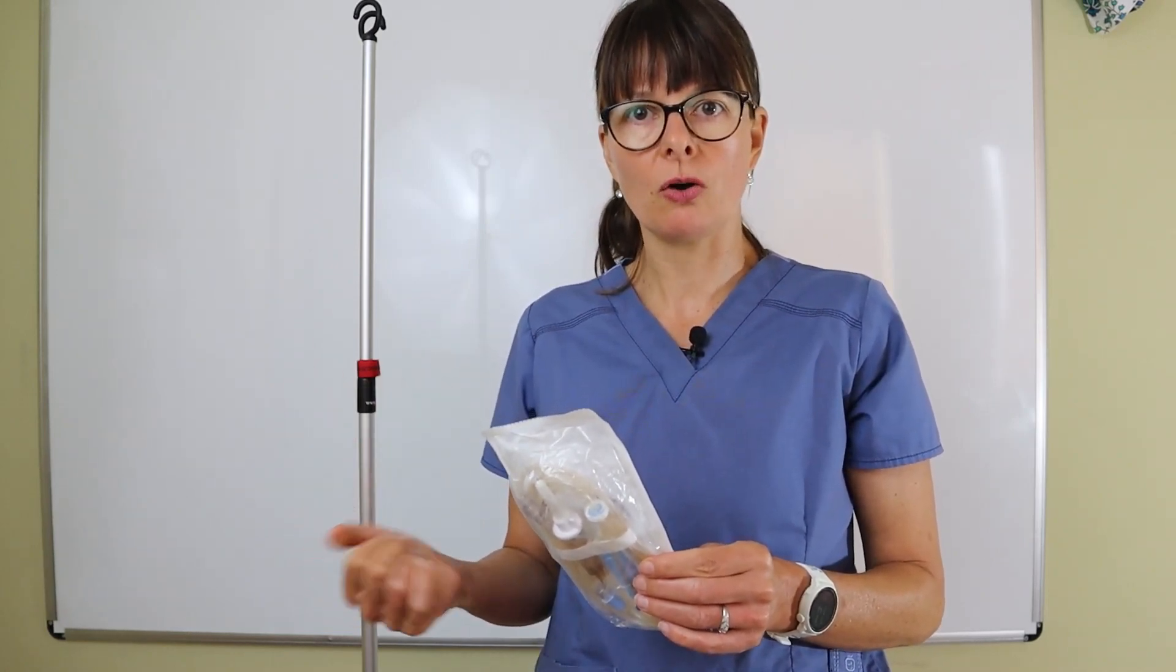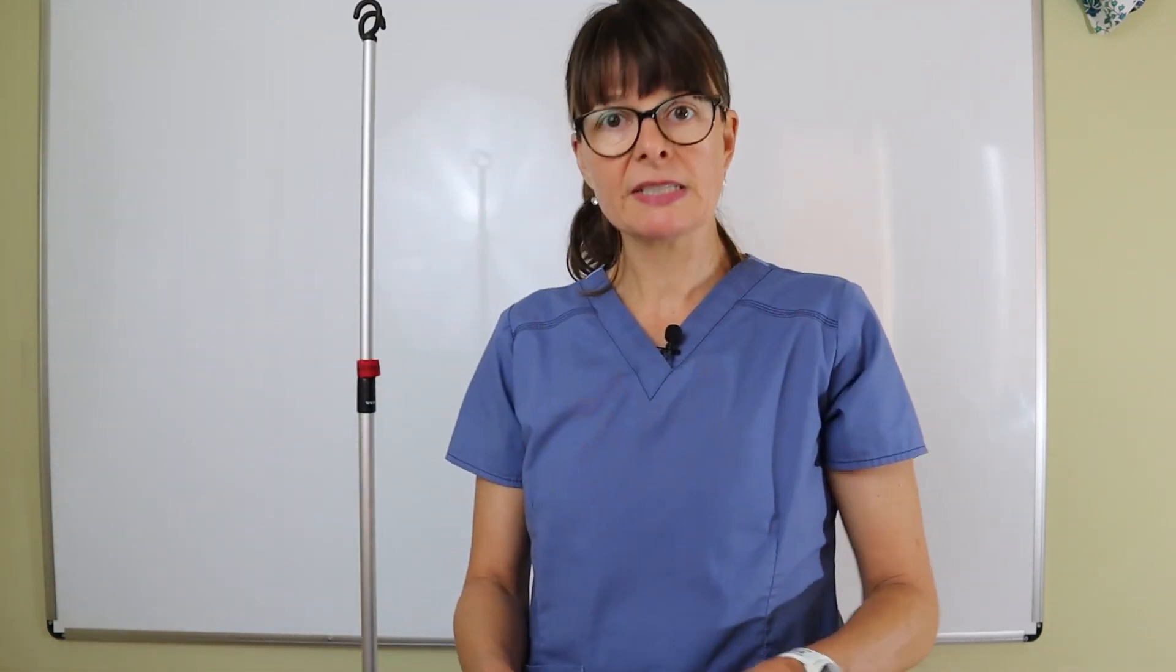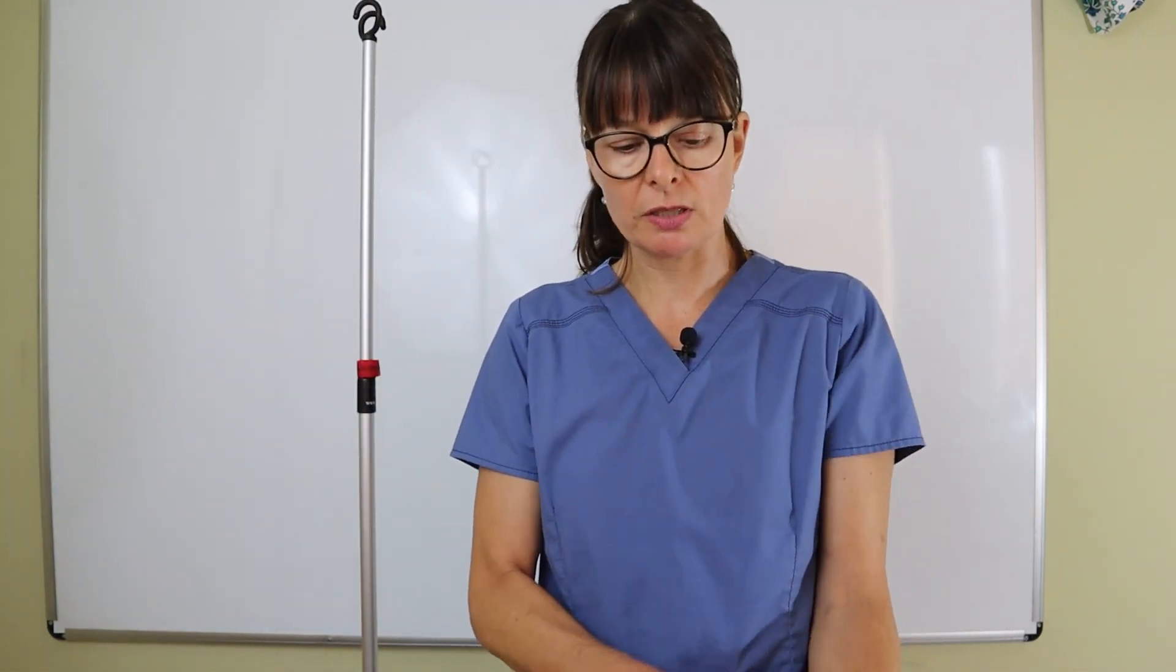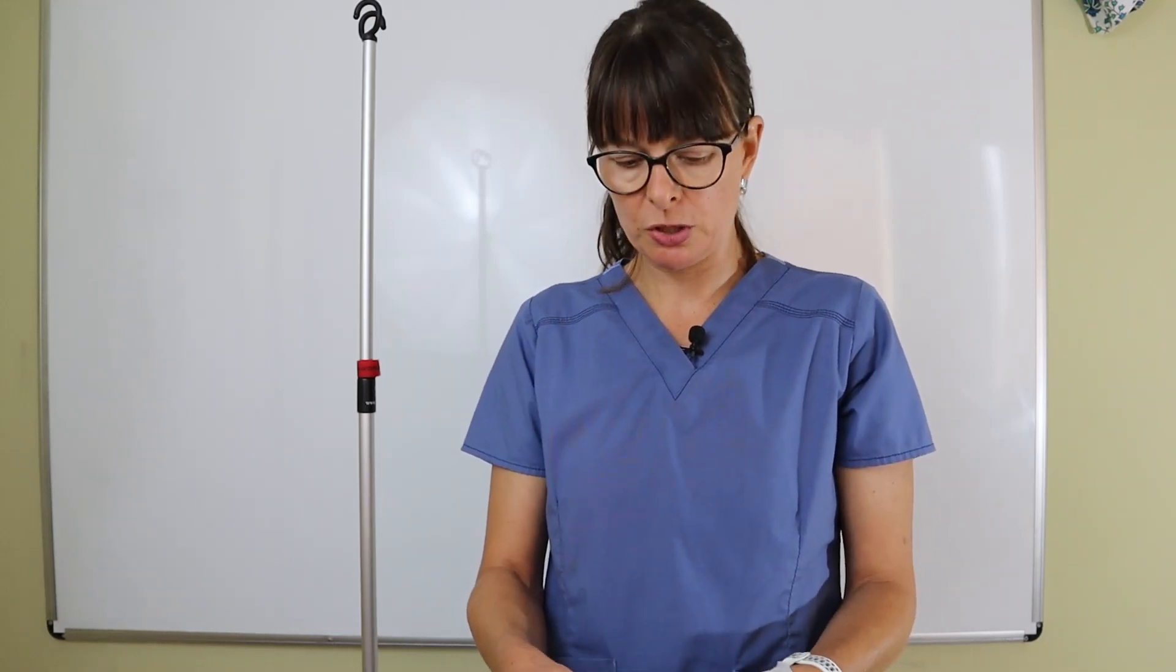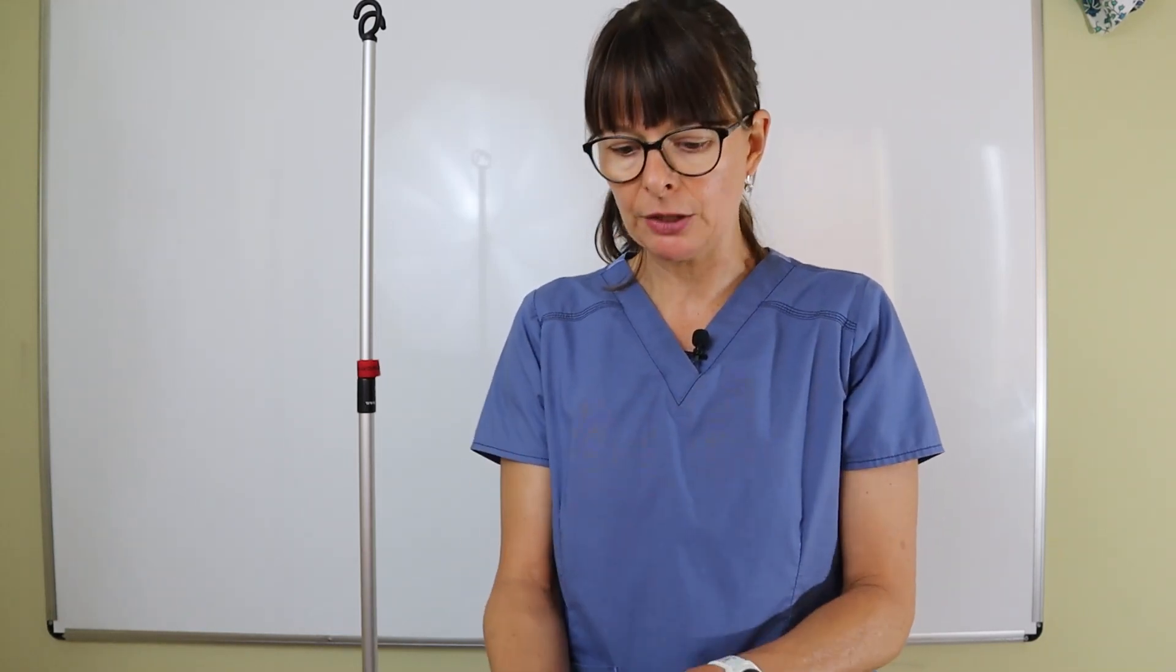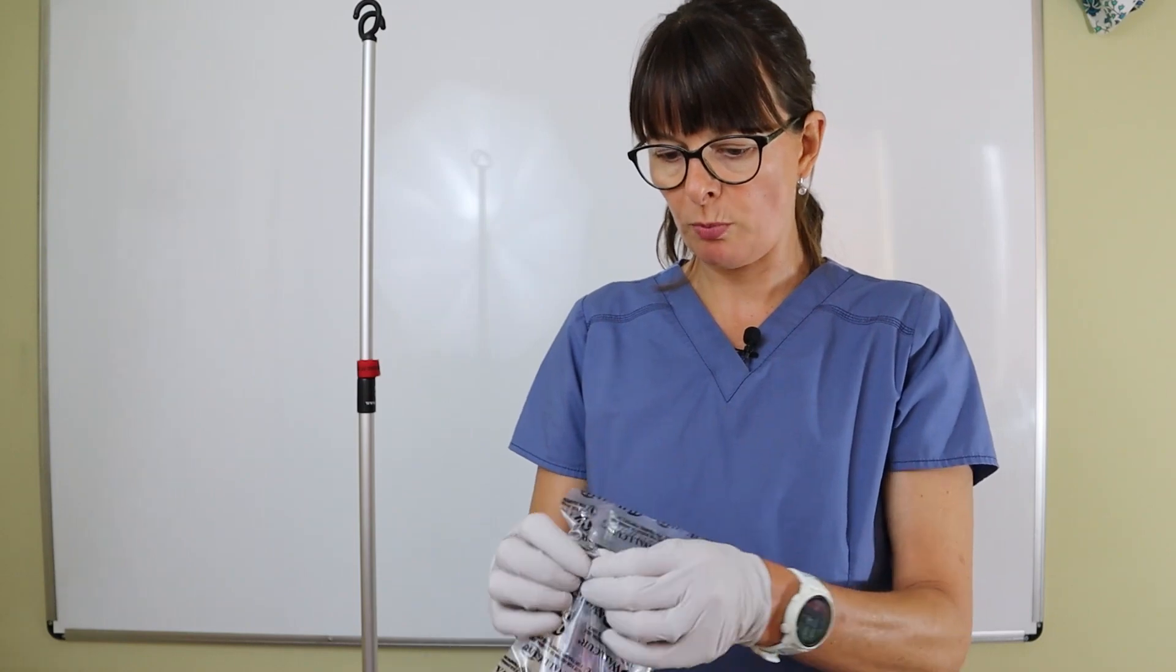You always want to use aseptic technique, performing hand hygiene as always. It helps to put on gloves because it keeps everything cleaner. We use our primary bag, which in this case is wrapped, so I will have to open it up.